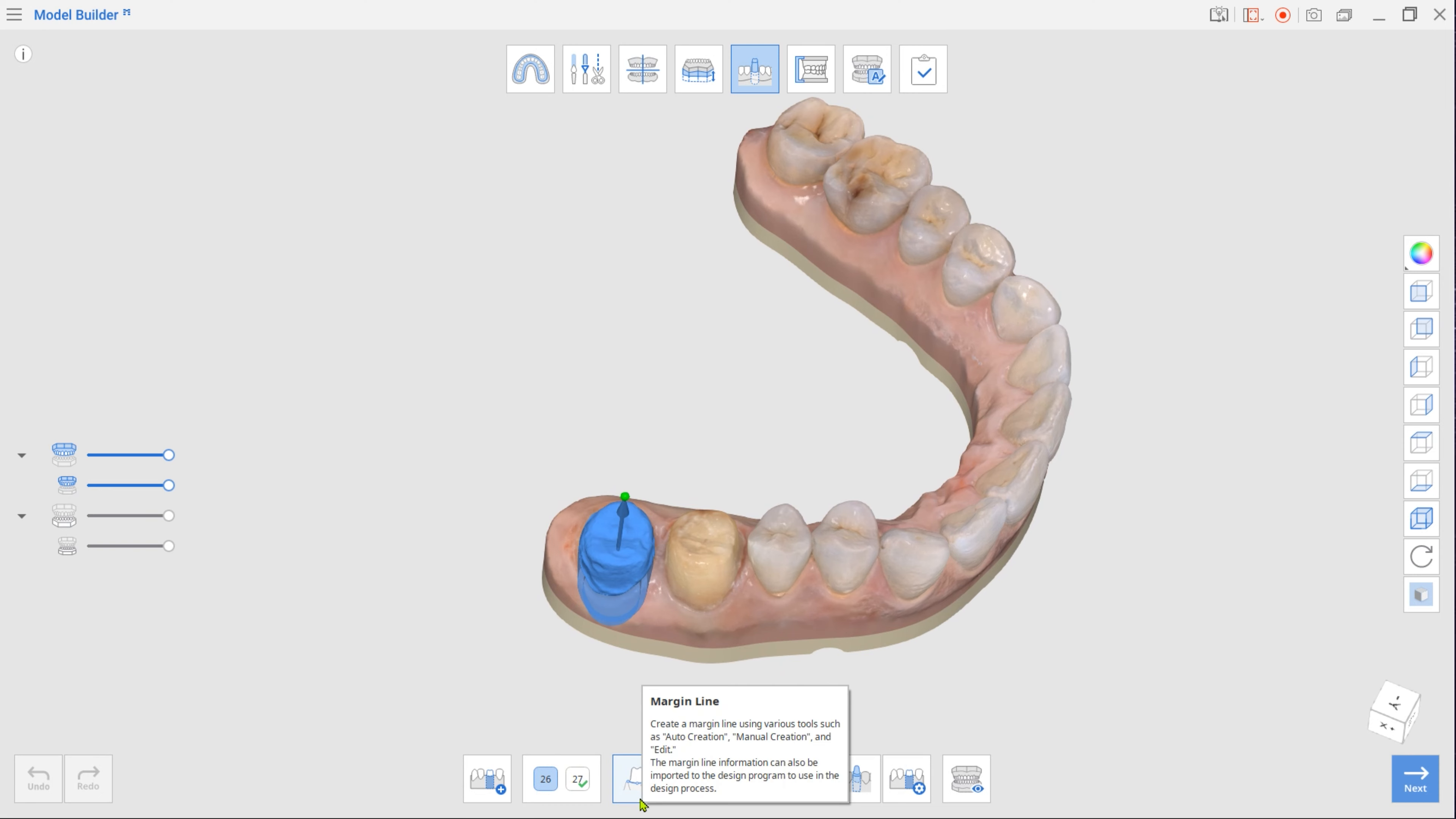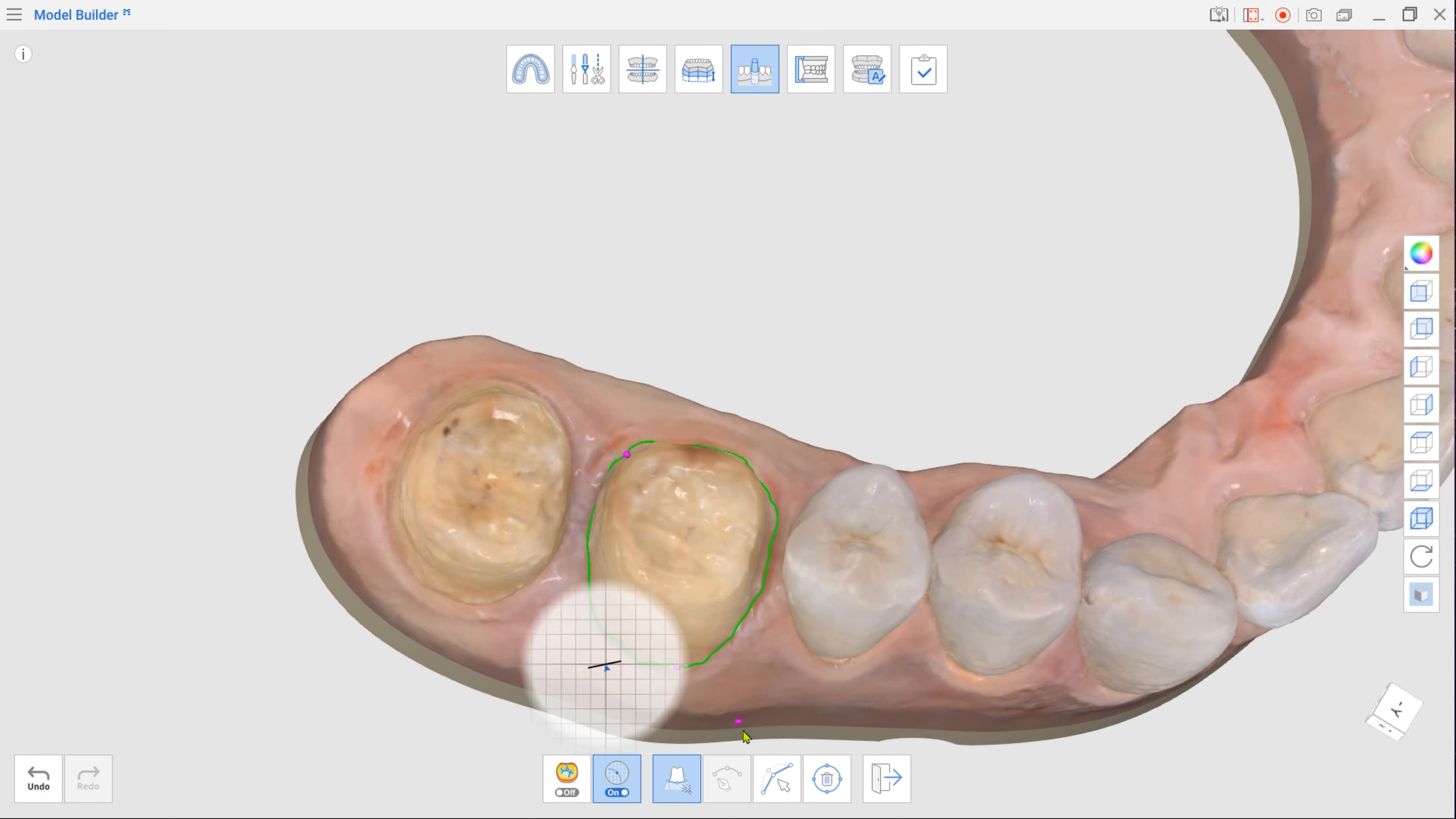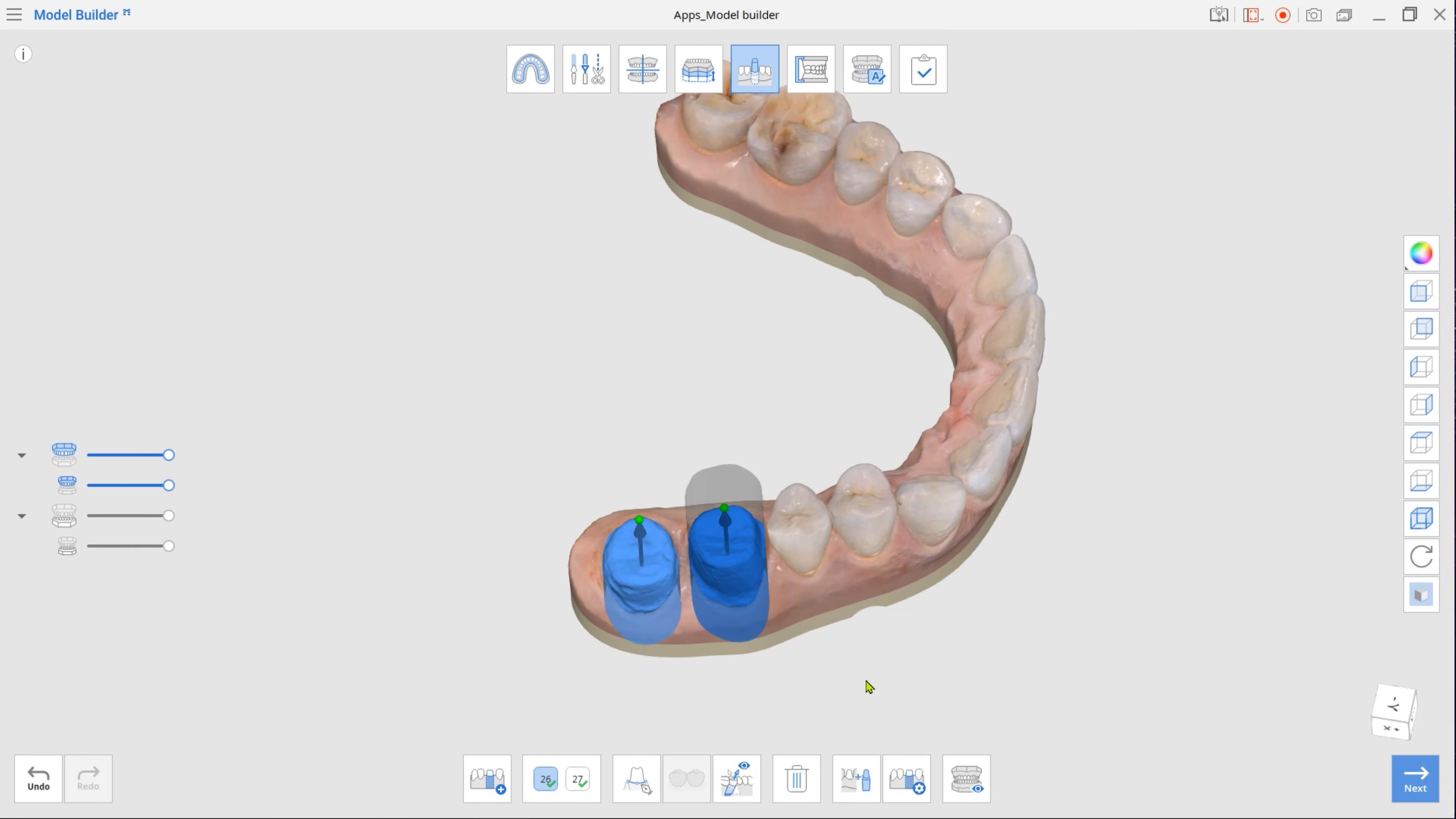Then, in the Margin Line toolbox, select Auto Creation. Zoom in on the prepped tooth and select a few points on the data. Use the Edit tool to correct the automatically created margin.